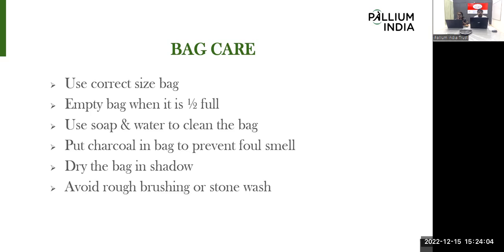Then for drying the bag, they need to dry it under the shade only. Under direct sunlight, we don't promote drying the bag, because overdryness from the sunlight may cause some cracks in the bag, and it will cause leakage. So we need to educate them. Also, if they are practicing brushing or stone washing while washing, we need to avoid that. We need to educate them to avoid rough washing of the bag.